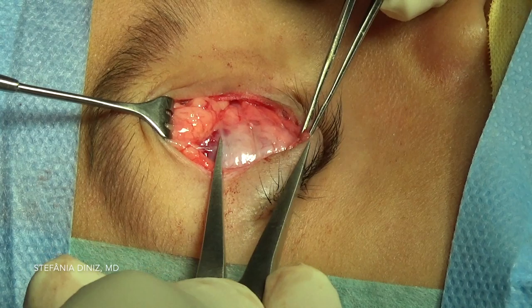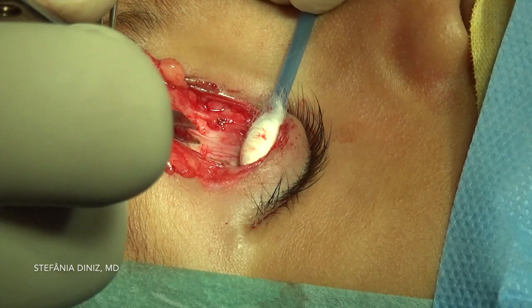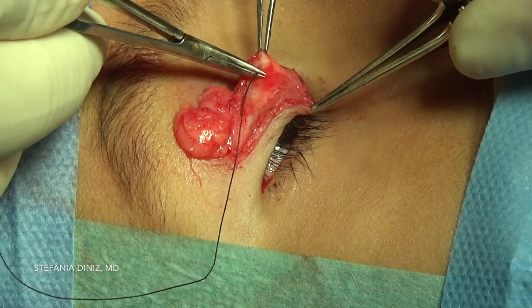An 18 mm resection will be performed. The amount of levator exposed depends upon the amount of advancement needed. Dissection is then carried out between the levator aponeurosis and the underlying Müller's muscle, performed superiorly towards Whitnall's ligament.